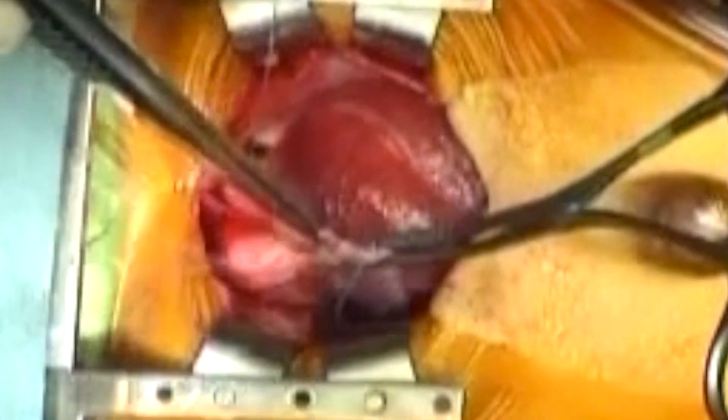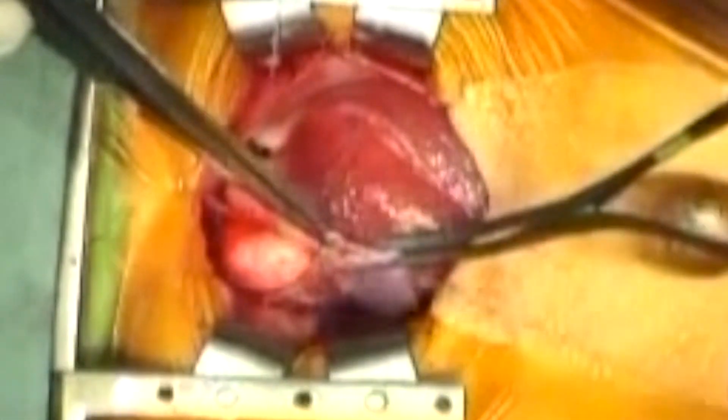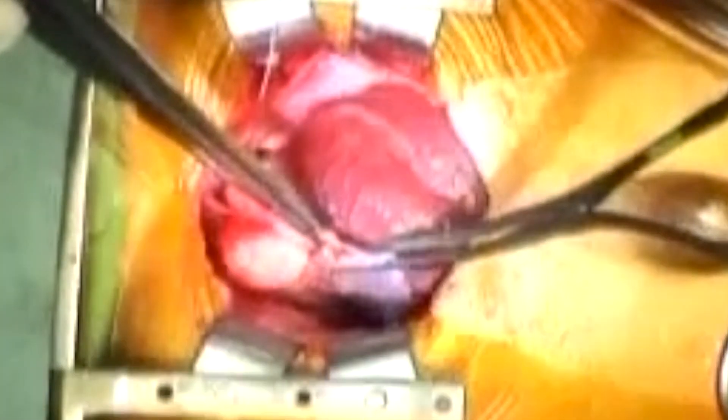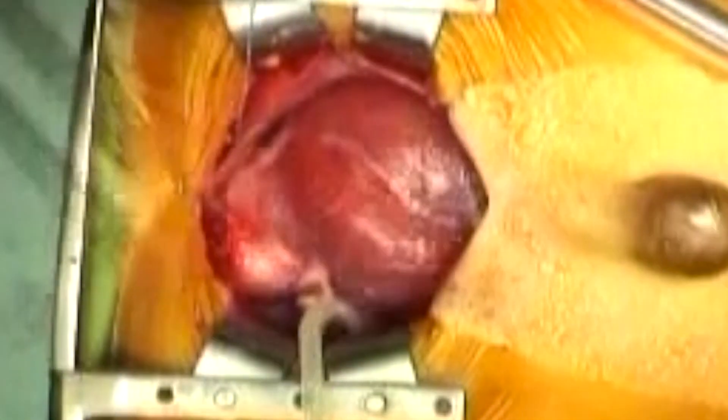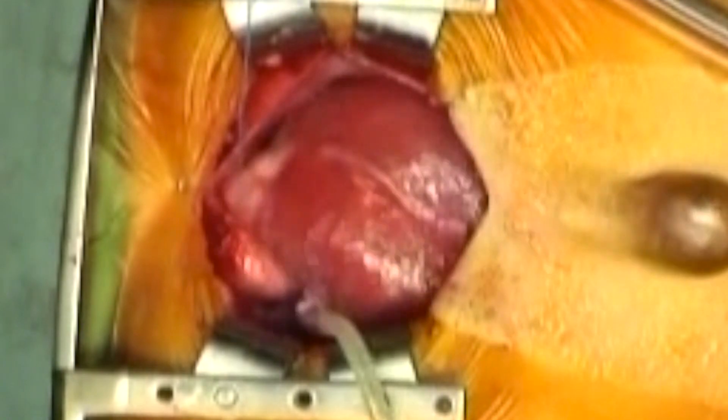Once the purse string is completed, both lengths of the suture are equalized, the needles trimmed off and the suture drawn through a snugger. With the snugger down tight, the clamp is released and preparations are made to cannulate the patient for cardiopulmonary bypass.